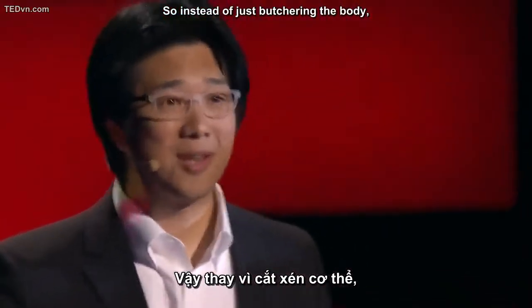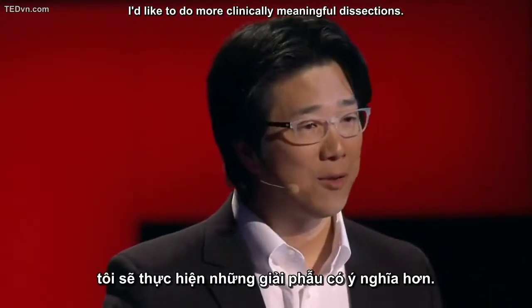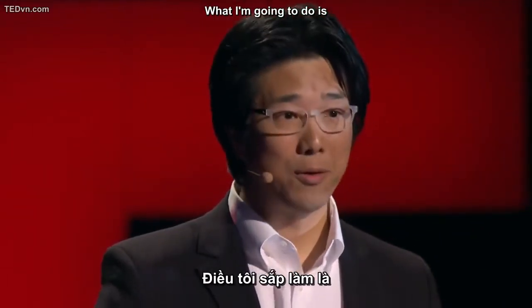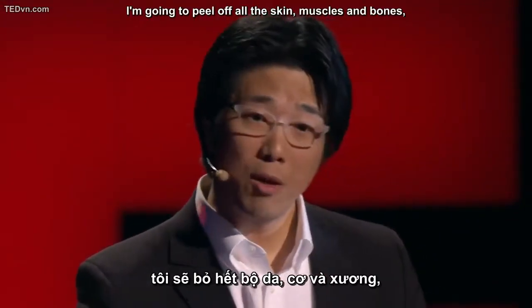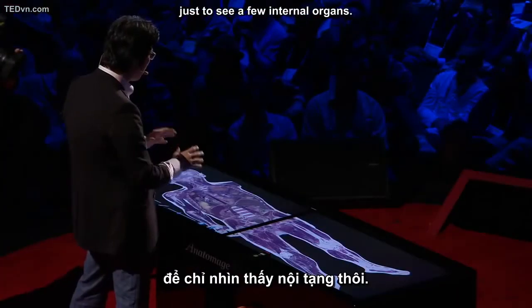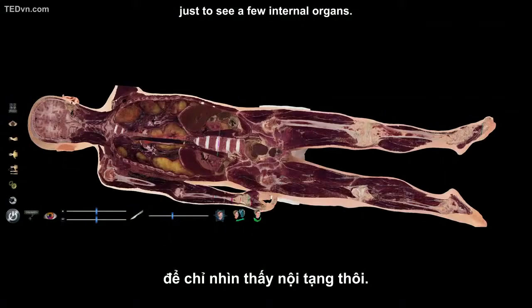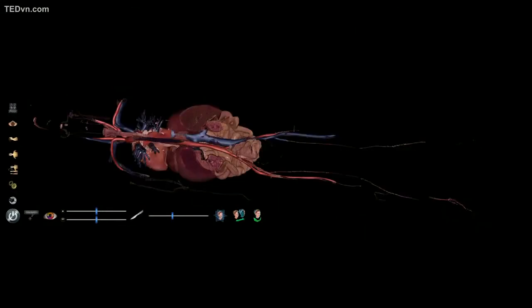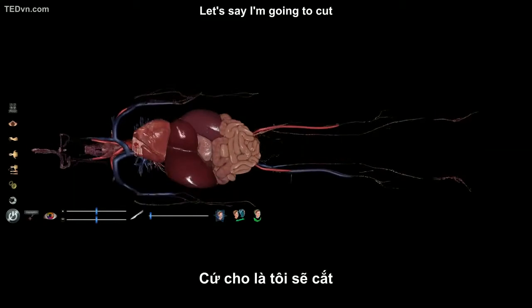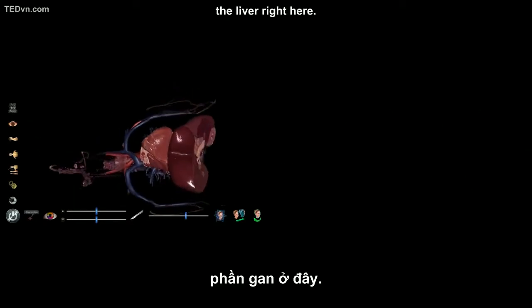So instead of just butchering the body, I'd like to do more clinically meaningful dissection. What I'm going to do is peel off all the skin, muscles, and bones just to see a few internal organs. Right here. Let's say I'm going to cut the liver right here.